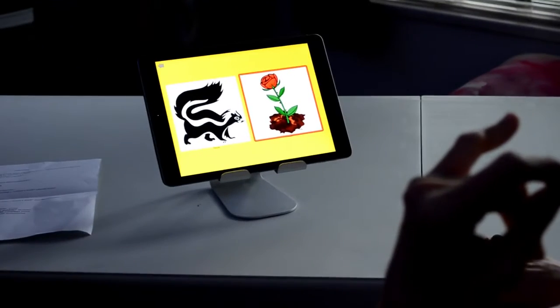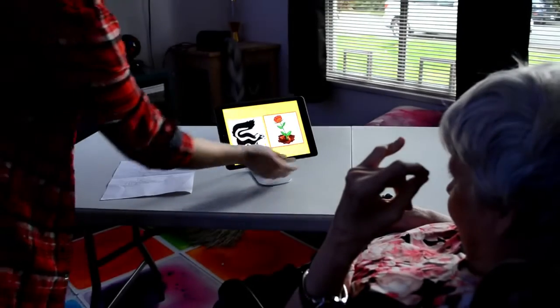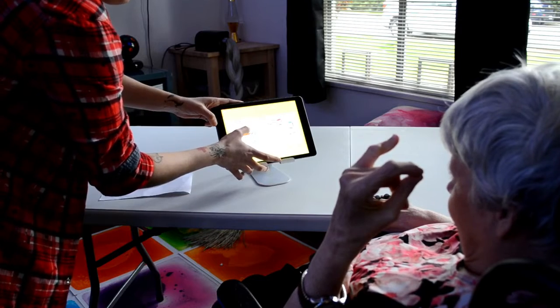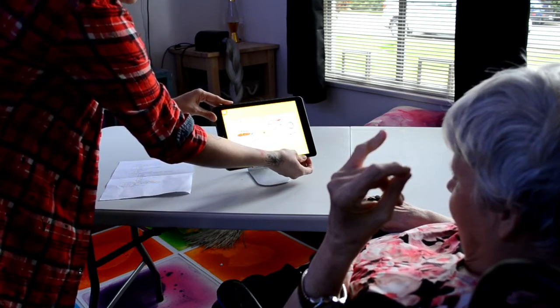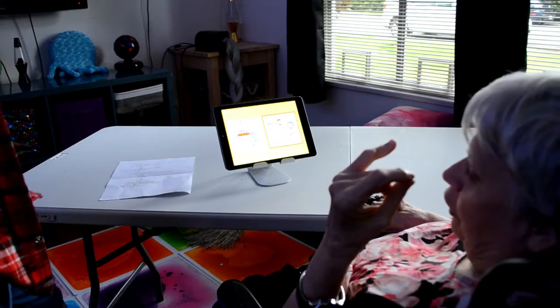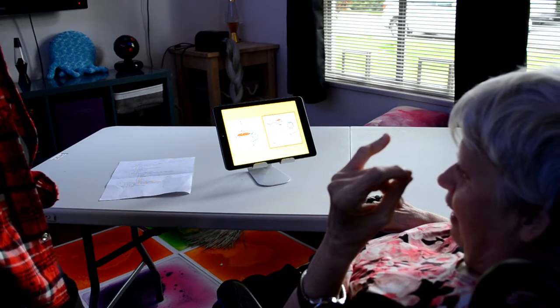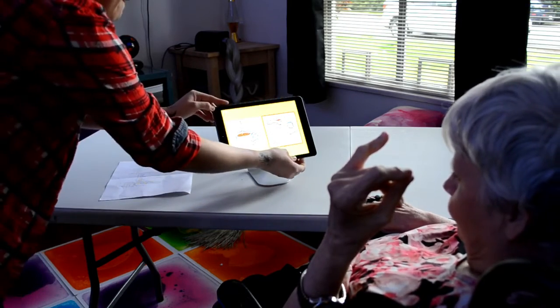I think the next step with this is going to be teaching the combination of skills of being able to go through multiple levels in a board. As you saw in there, we were using just one single board, but being able to select a button and then have that open for more buttons requires using two different input methods. And obviously there's some learning that goes along with being able to do that. Yeah, I think that's the next step.